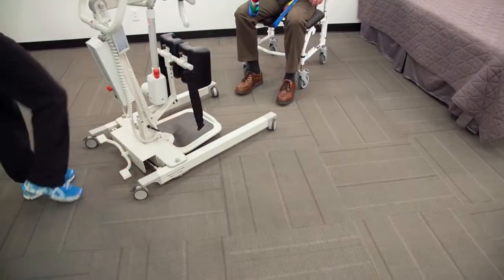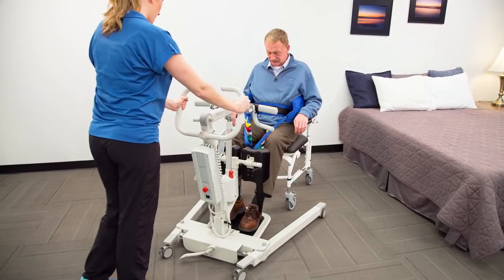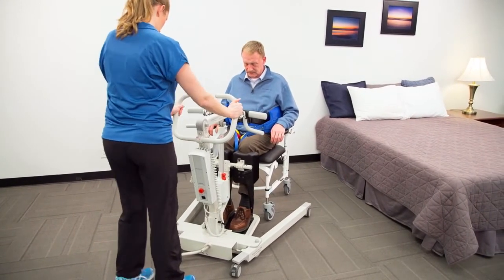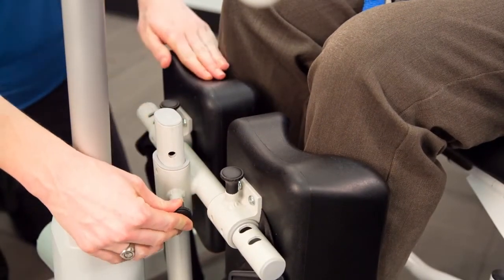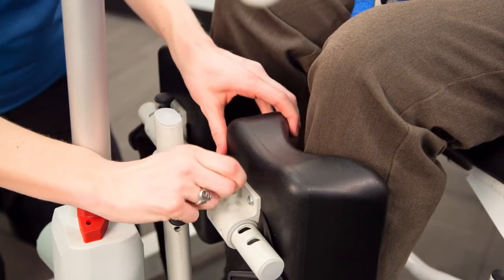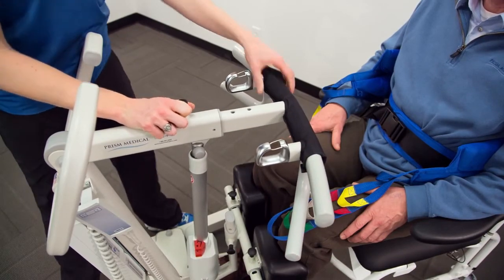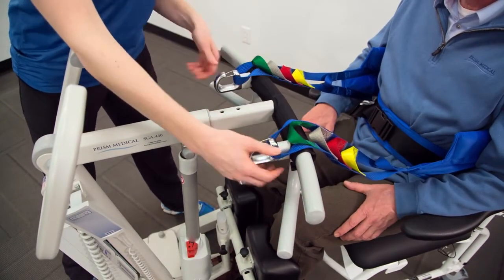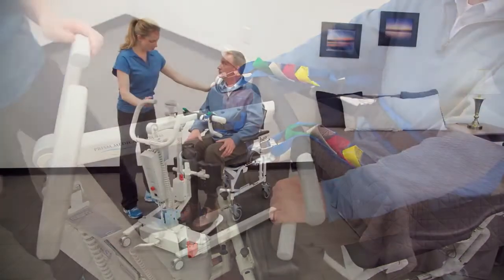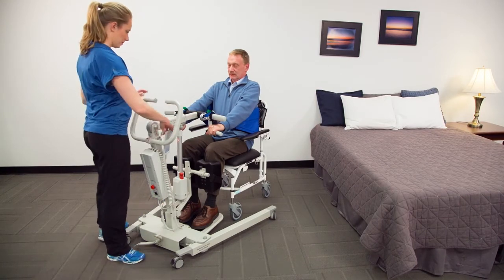With the sling properly applied to the patient, spread the device's legs if needed and move the lift towards the patient. Have them place their feet fully on the footplate and shins against the shin pads. Lock the wheels. Adjust the height of the shin pads so the top of the pads are two to three inches below the patient's knee. Adjust the width of the shin pads so the patient's shins are vertical. Secure the safety strap around the patient's legs. Adjust the yoke to the desired length to reach the patient and connect the sling loops to the connection hooks. Once connected, instruct the patient to hold on to the grab handles and lean back into the sling. Check that the loops are properly connected to the hooks.